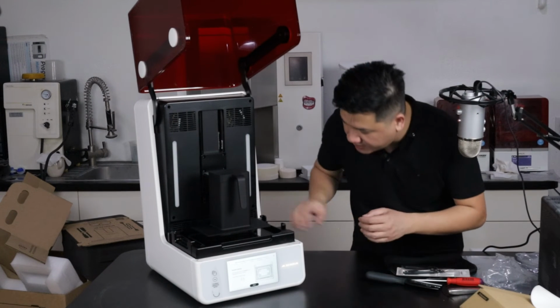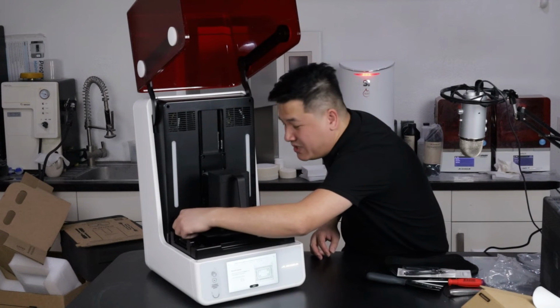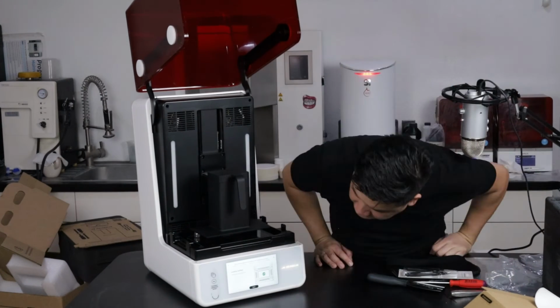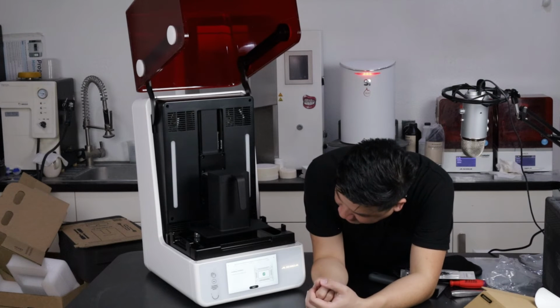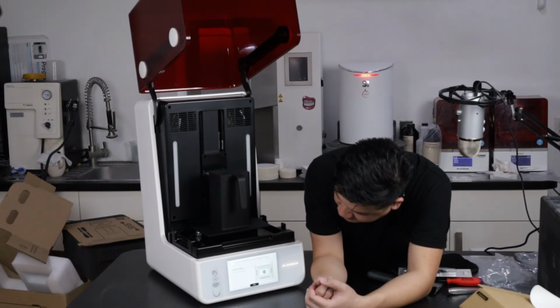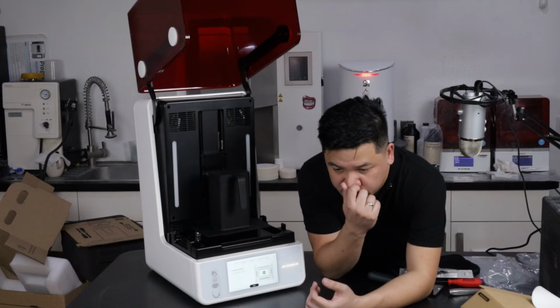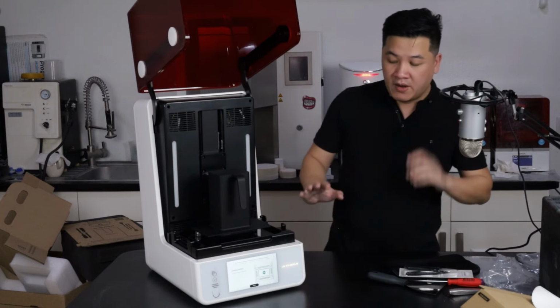Okay, and then we're gonna put it on our last corner here. I'm getting fingerprints all over the glass. Usually I do this with gloves, but I don't have any gloves on right now. But leveling verified. So if we look at, wow, that's impressive actually. So I do parallelism tests quite often on all of our printers just to make sure they're well calibrated and very parallel.